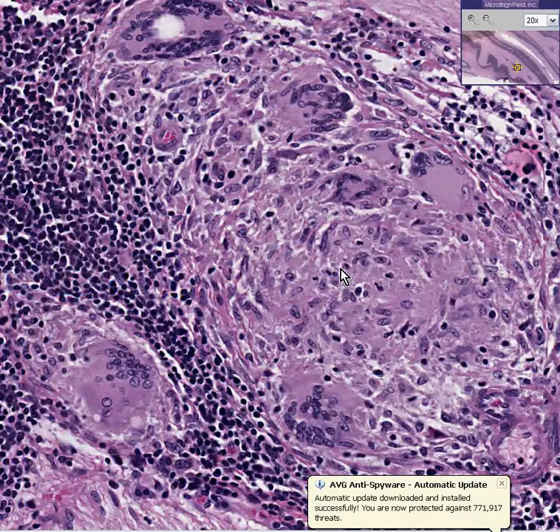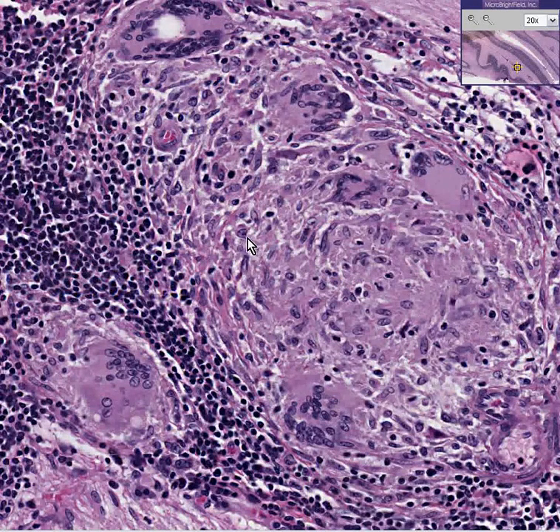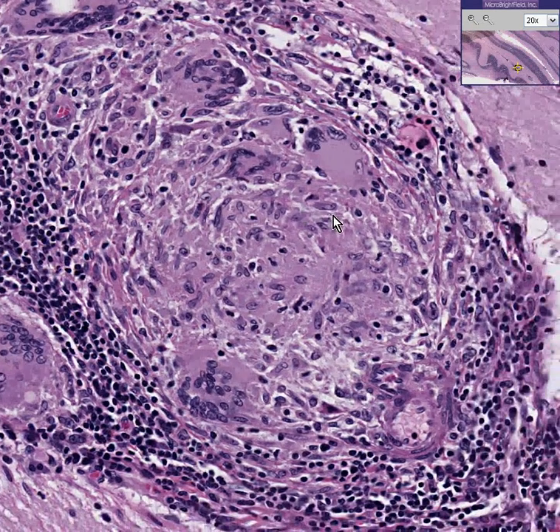They do not have any caseous necrosis, and therefore they are not caseating granulomas, but they are granulomas that have large giant cells, a lot of epithelioid histiocytes, some of them coalescing to form giant cells, and a lot of lymphocytes at the periphery of the epithelioid cells and the multinucleated giant cells.